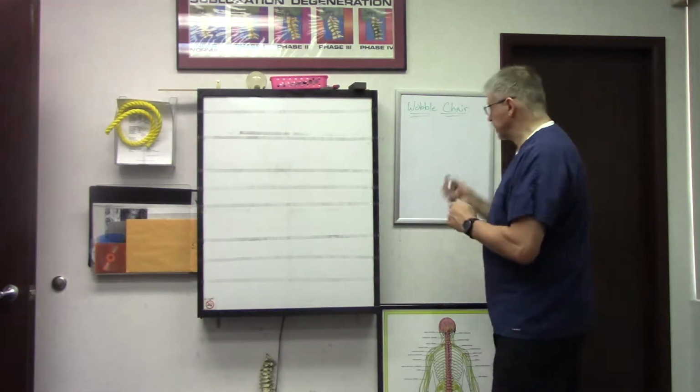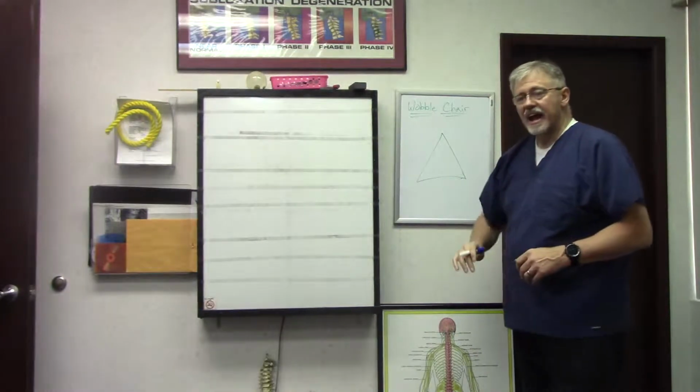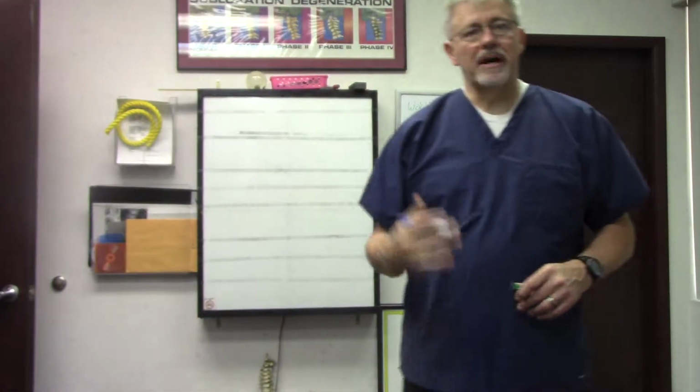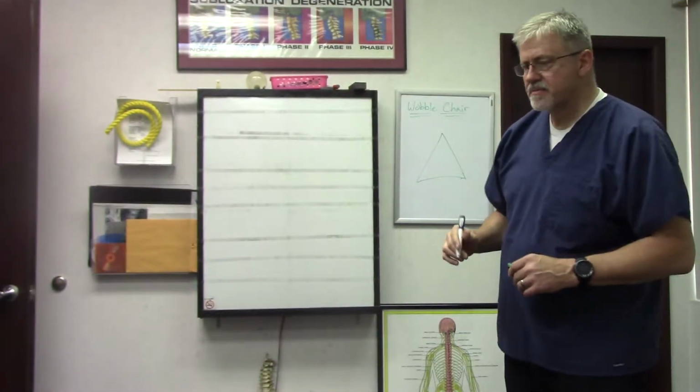And in this case, the Wobble Chair was designed by Dr. Burl Pettibon some time ago. We use it to warm up the tissue. Recall when we've talked before, we talked about the three tissues that have to change. Those three tissues, if we don't change those, we didn't affect a structural correction that is maintainable by the patient after we're done. My job is to put myself out of business.